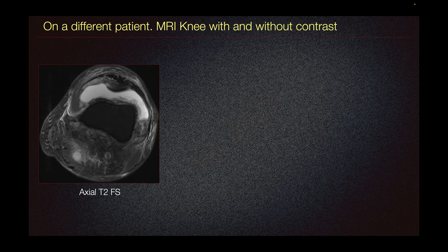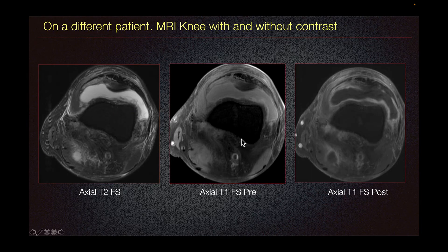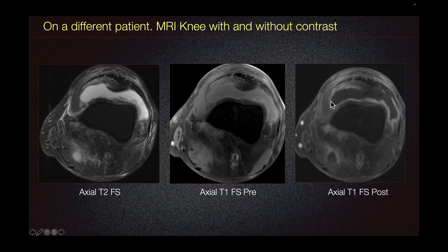On a different patient, again, we have MRI knee with and without contrast. We can see this non-contrast axial T2 fat sat imaging demonstrating large joint effusion with likely some synovial thickening in the posterior margin. This is better characterized on our T1 fat sat post-contrast imaging, where we can see the synovial thickening pretty clearly — there are fronds in the posterior margin and also circumferentially, consistent with synovitis.